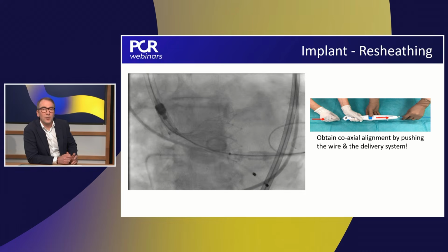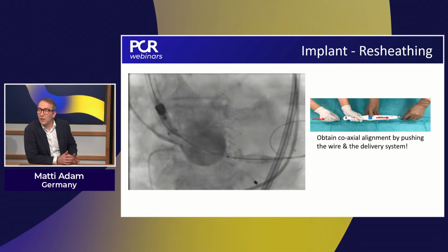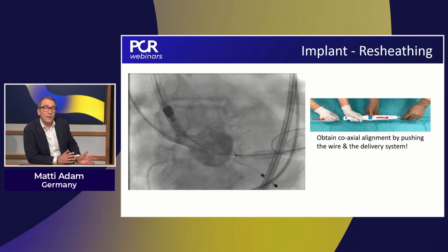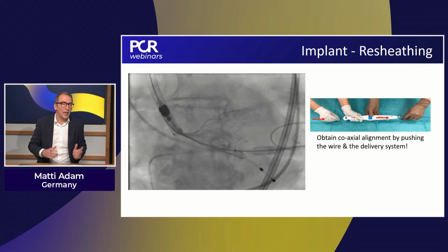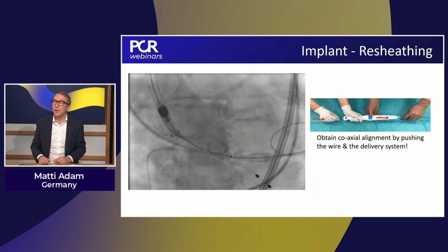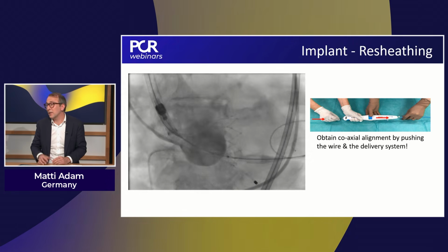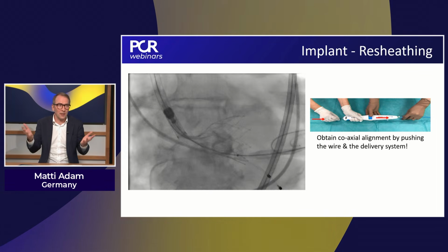I wouldn't have been happy as well. I mean, why not? You're not coaxial. You're high on the left, you're deep on the non, you're super outer. The valve might actually move, centralize a little bit more when you release it, and then it's probably coming down on the left, and you're deep on both ends. I agree with you. We would not have accepted. And you also have parallax, right? So it's a lot going on here.